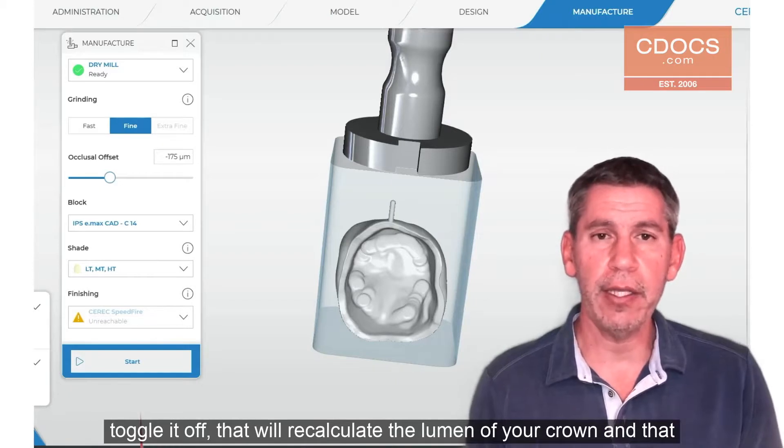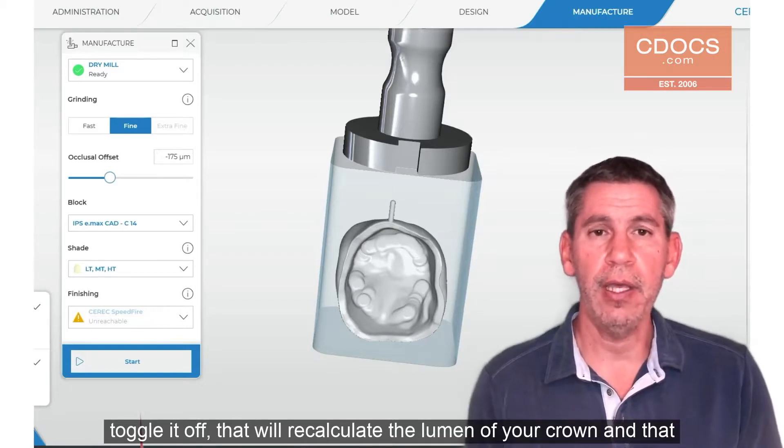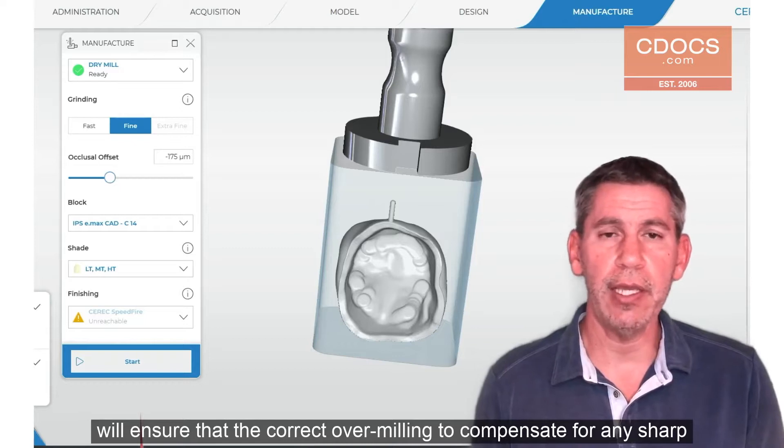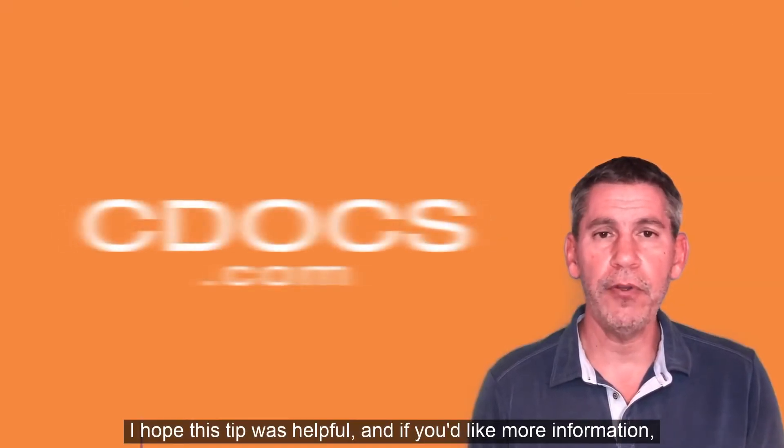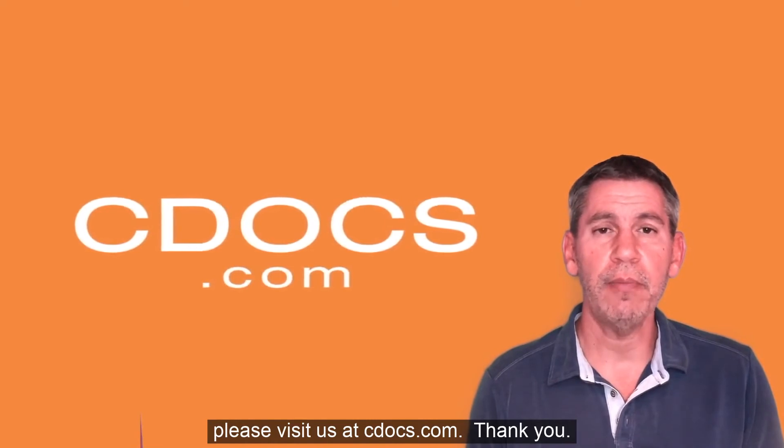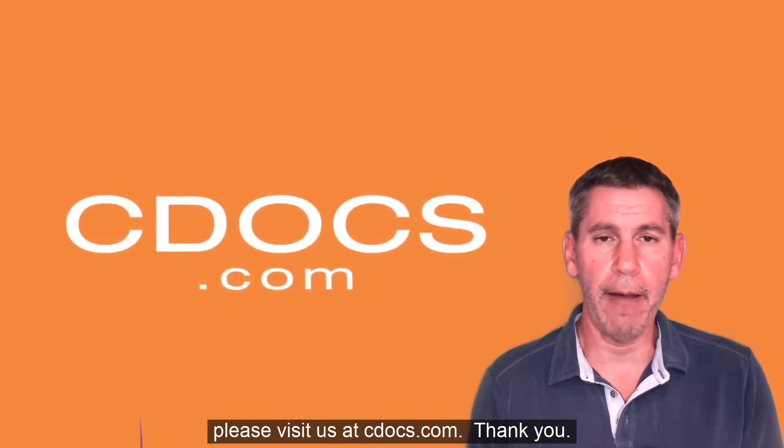That will recalculate the lumen of your crown and will ensure that the correct over milling to compensate for any sharp areas of the prep are taken into account, and your crown will seat every time. I hope this tip was helpful, and if you'd like more information please visit us at cdocs.com. Thank you.